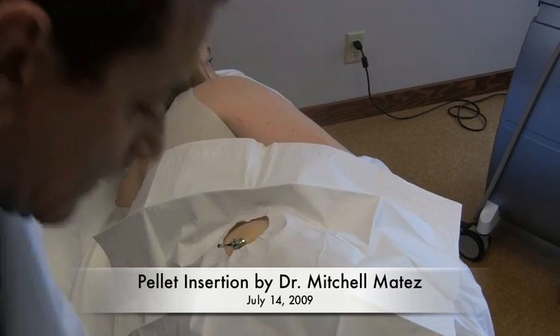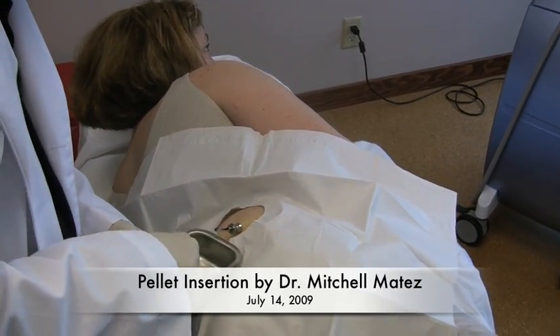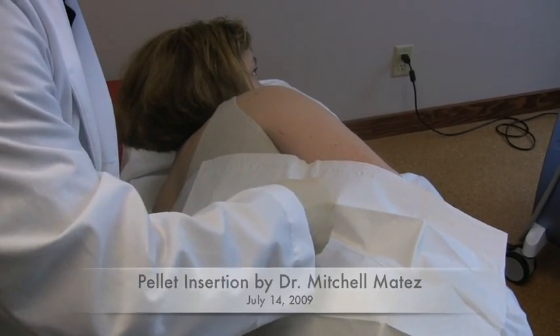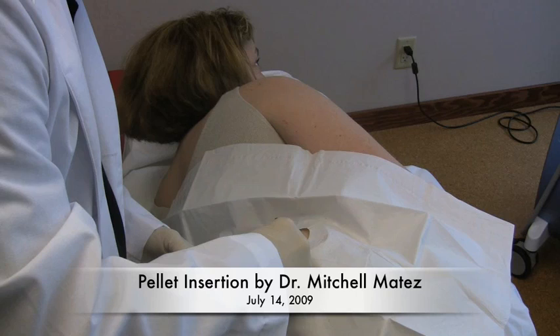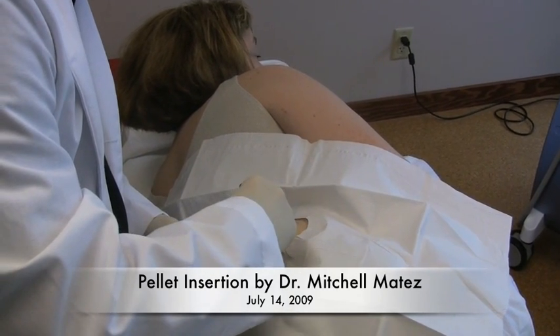Still doing all right? Yeah. We are almost done. We've actually put the trocar in and we are about to put the pellets in right now. You will be receiving three pellets today — one estrogen pellet and two testosterone pellets.